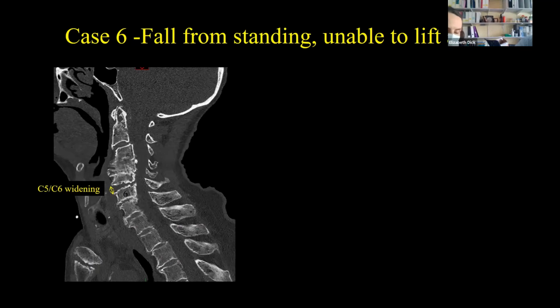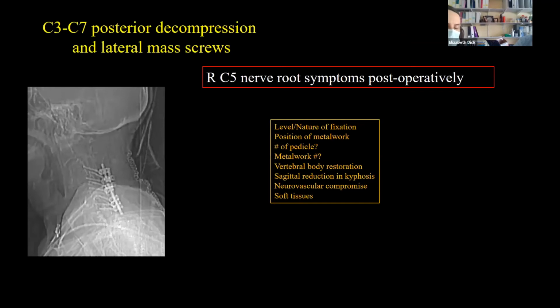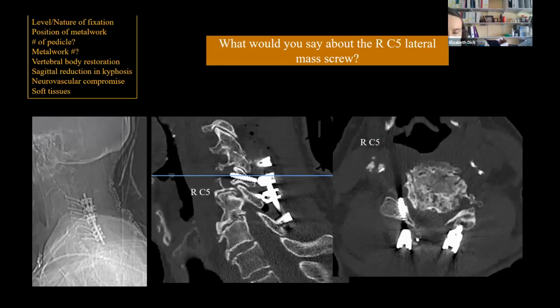They acutely were unable to raise their arms, and you can see that actually they've had a hyperextension injury at C5-6. They've torn the ALL, they've got cord contusion. So this patient had posterior decompression from C3 to C7, and when they woke up, they had right C5 nerve root symptoms. So I'm just going to show you a segment through the right C5 level, and here's the lateral mass screw here. And I just wondered if anyone would like to comment about the C5 lateral mass screw and its relationship to the neural foramen.